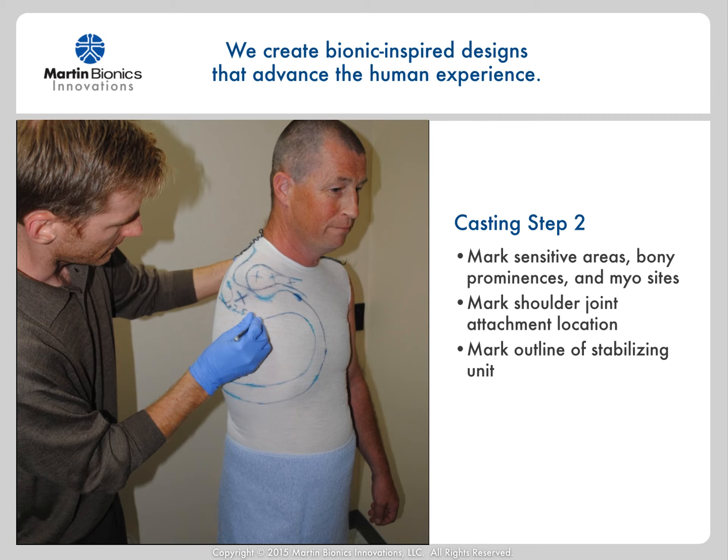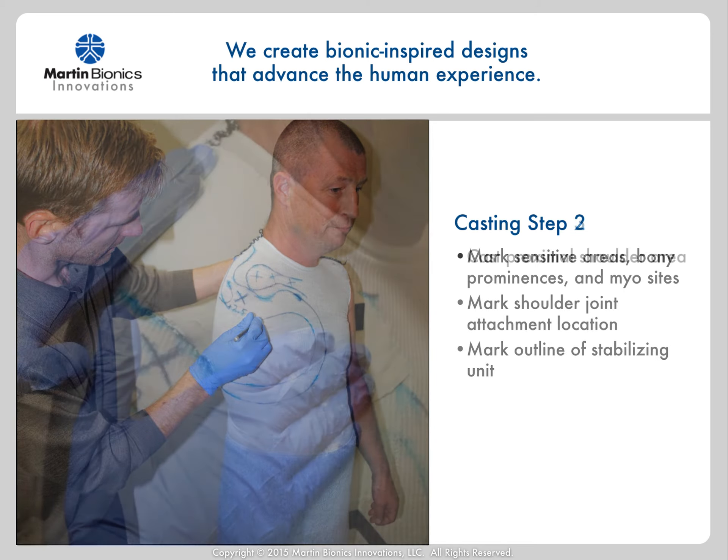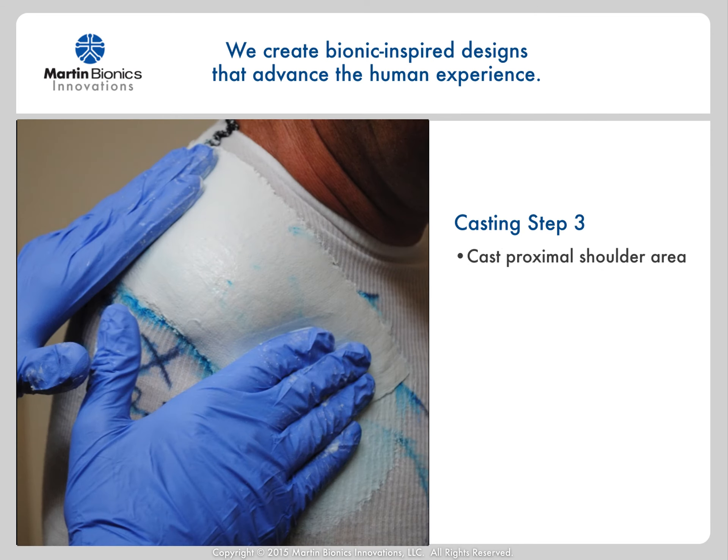In the modifications, we'll build up the shoulder joint attachment area as needed, but these markings will show the placement location and trim line contouring. Once all the marks are in place, I'll begin by laying a plaster splint over the top of the shoulder to capture surface contouring. We don't need to get aggressive in the deltopectoral groove or supraspinatus areas, but we do want to capture a defined contouring.